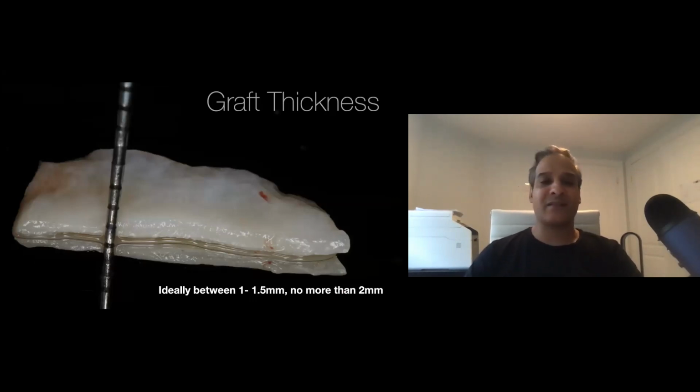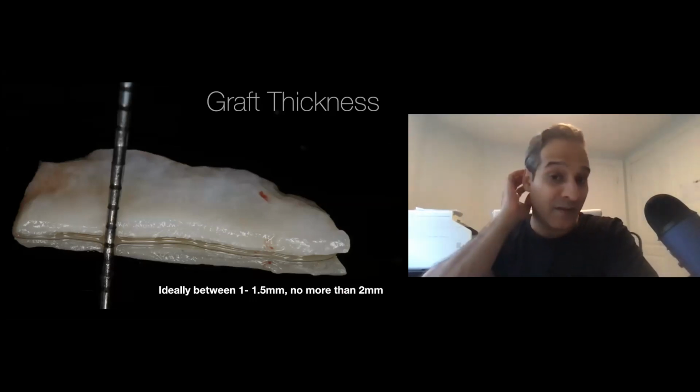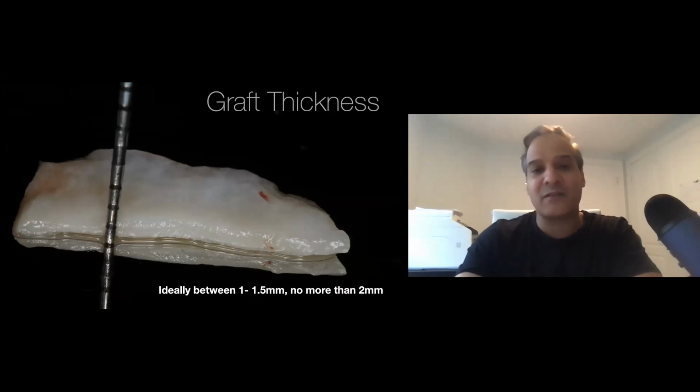This has to do with the fact that the graft itself has to regain vascularity. If it's too thin, it doesn't gain enough blood supply soon enough, and it ends up necrosing. If it's too thick, a lot of that volume is lost because it takes too long for the blood vessels to grow into the graft. Sometimes we always think a big, thicker graft is needed. It's not always needed.